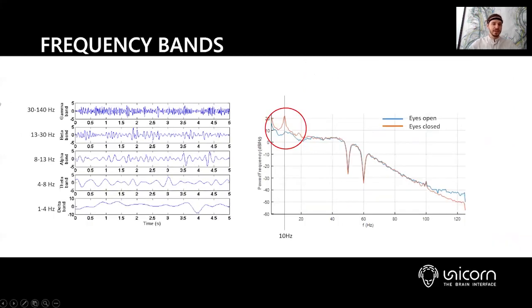And then we can do different things. For instance, we can measure frequency bands. So we might be interested in frequency bands if we want to measure focus or some task-related frequency band changes. Or for sleep EEG, I guess most people know that there are different frequency bands, like the delta band, which is a very low frequency band, ranging from 1 to 4 hertz. You will find these signals mainly in deep sleep. The theta band, you will measure that in a transition between sleep and awakeness, or in a very relaxed state. Then we have the alpha band.